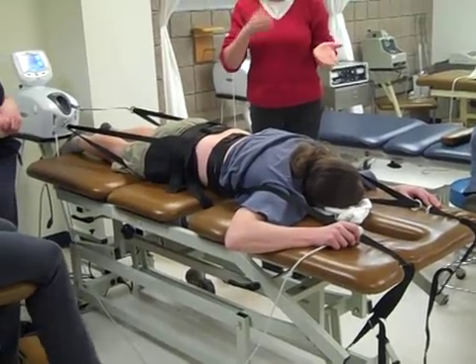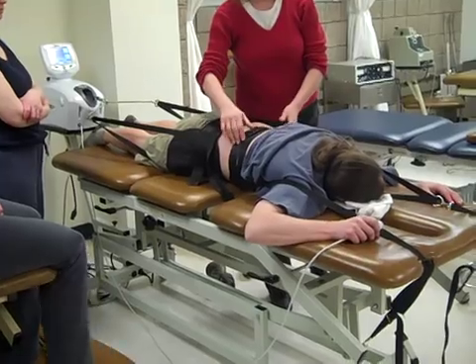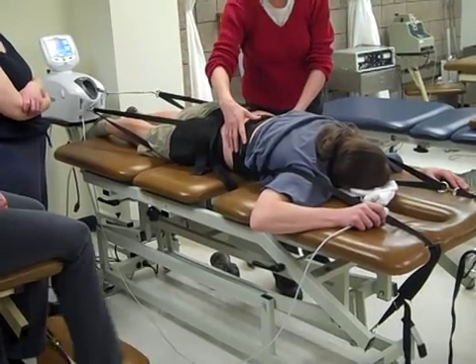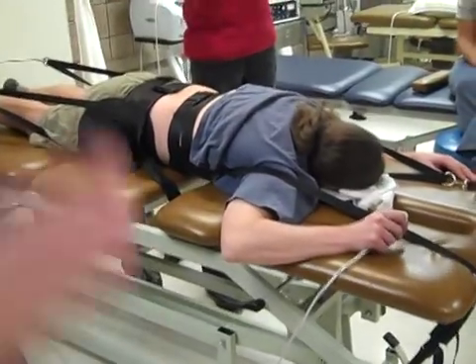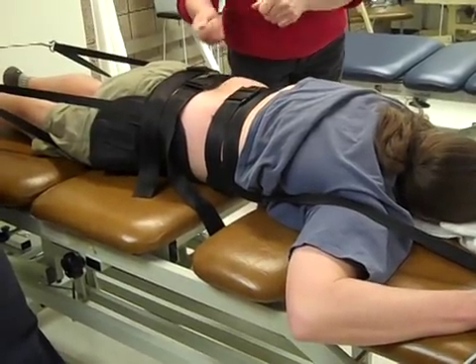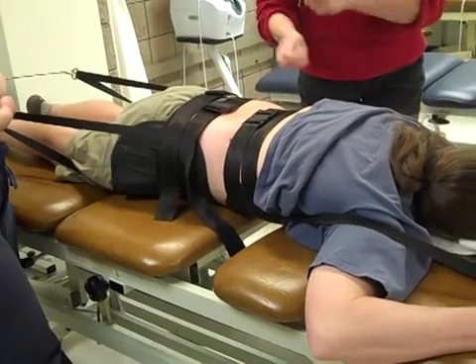is 50% of his body weight. And so by using that little heavier body weight, see what happens when the belts are just a trifle too loose. And see what happens? Oh my God. Loosen more. They do loosen more, yes, because that machine pulls everything down into a certain position, and then it might be too loose. So tighten the belts, hook the machine up. Before you start it, go back, tighten again.